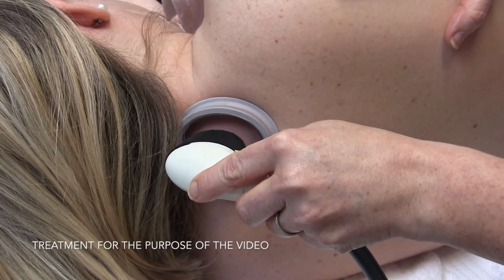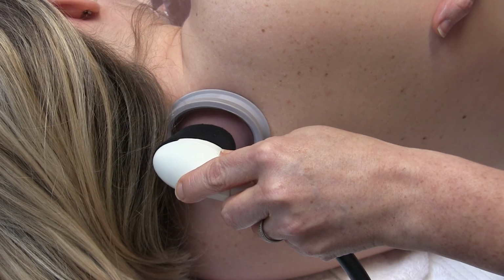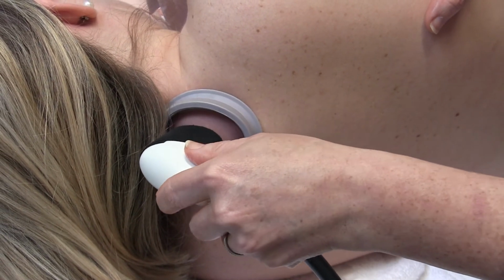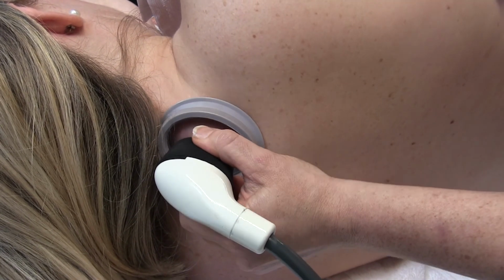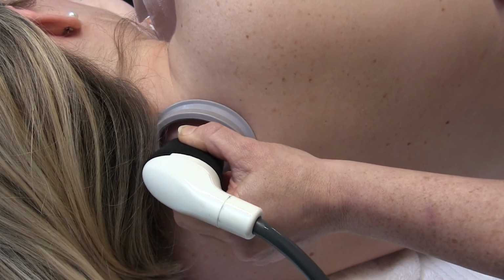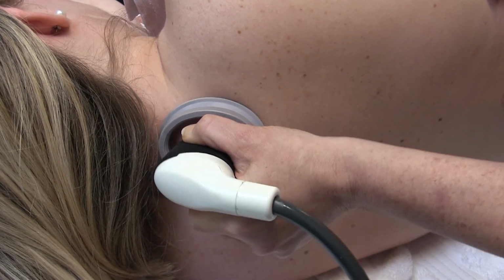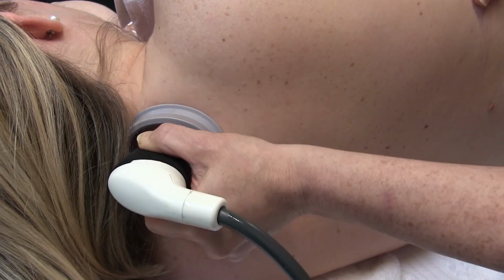With MLD, we always start at the neck. So first of all, open up the neck area. Let's say for instance, lymphoedema is in the left arm. So open up the neck, open up the axilla on the other side as we always do, open up our pathways intercostally around the abdomen, and then usually if there's any fibrotic tissue, I'll be using the HYVAMAT.